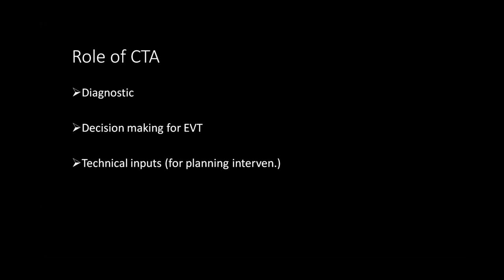More than anything else, logistics has dictated this practice because MRI is physically a little removed. So our experience is also much more in CT and CT angio. Let me come to the CT angiography.